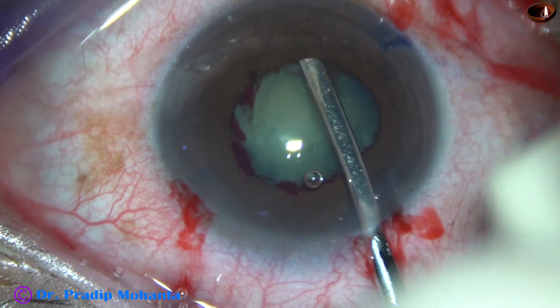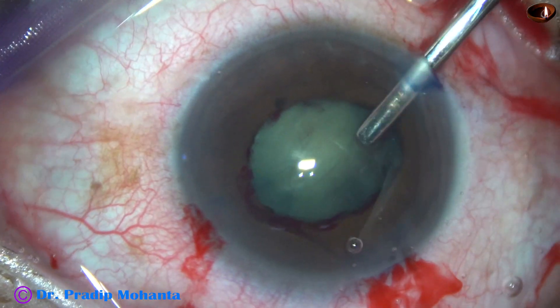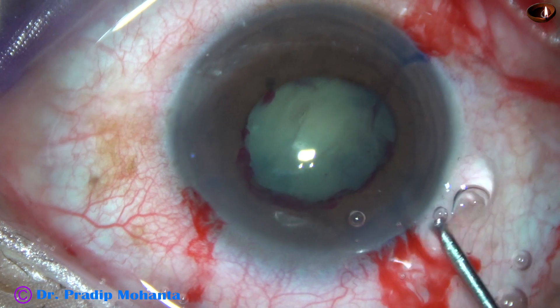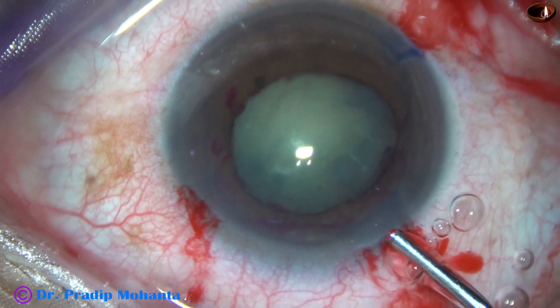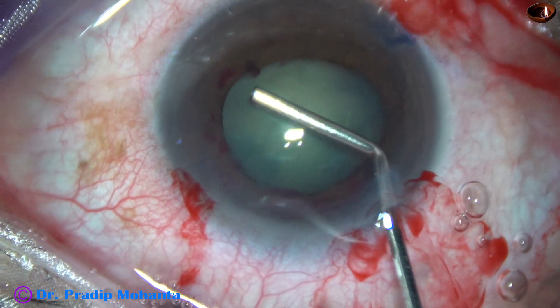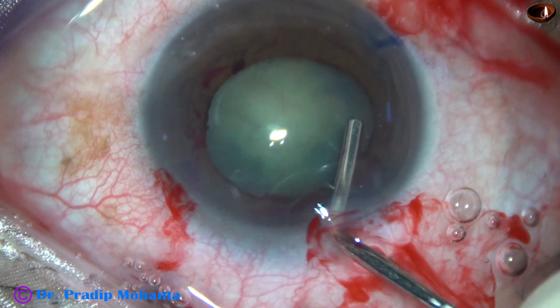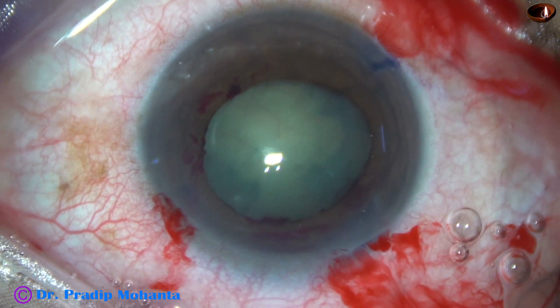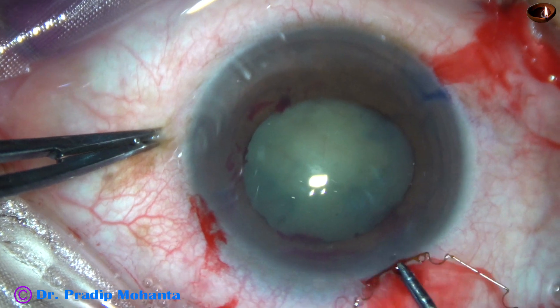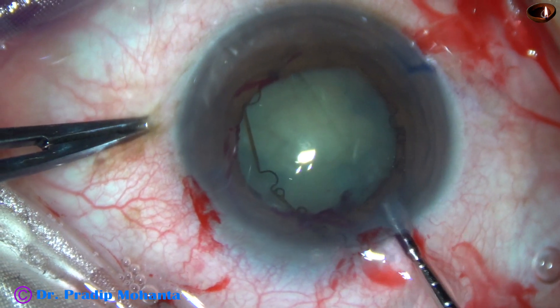This is an iris spatula, checking if there is any synechia anywhere. And now viscoelastic is injected. The size of the pupil is about 4.5 millimeters, so I thought of using a Bhex pupil expansion device. But see what happens during application of the Bhex — the leading flange is stuck, and the trailing flange is stuck in the wound.